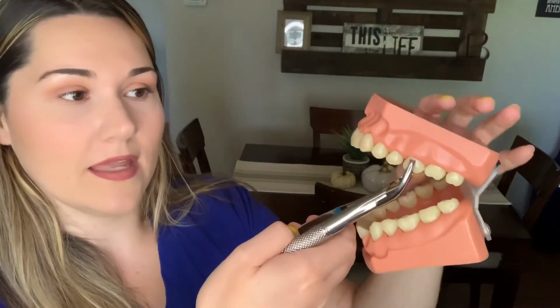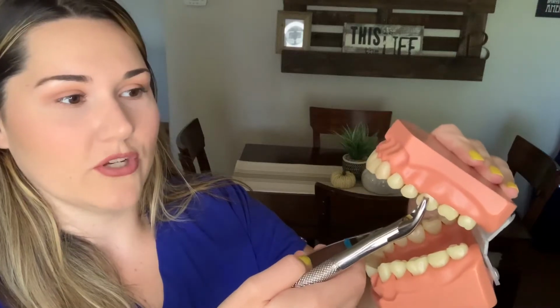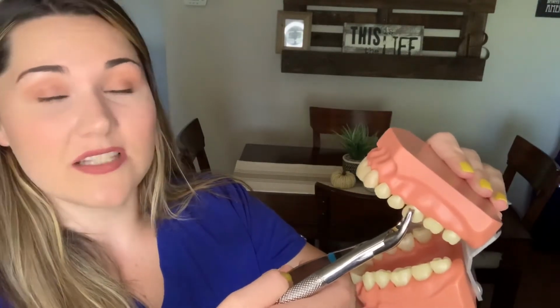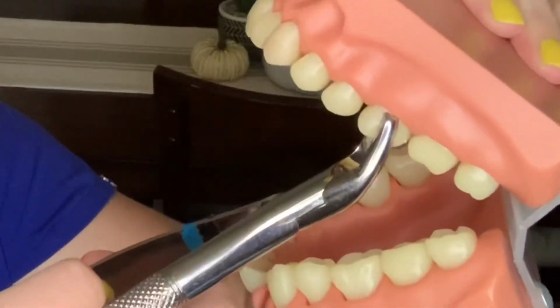Okay. And then he will start to wiggle it back and forth, which I think I'm definitely gonna extract this tooth. And there's gonna be lots of noises, there might be cracking, there might be popping. That's completely normal. It's just the tooth loosening out of the socket. So wiggle, wiggle.